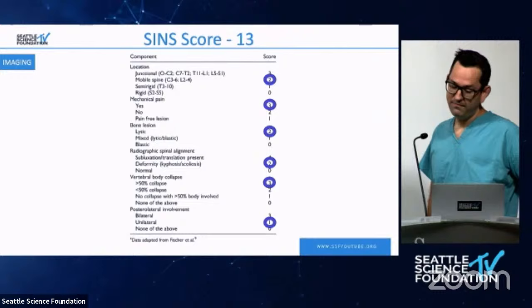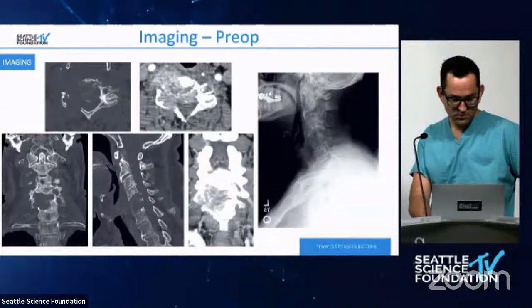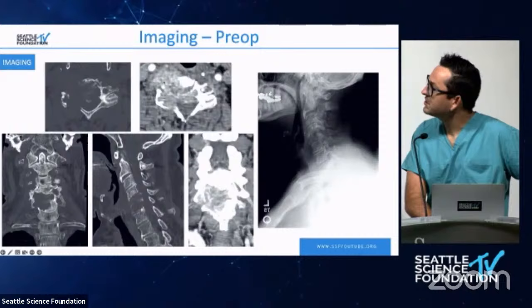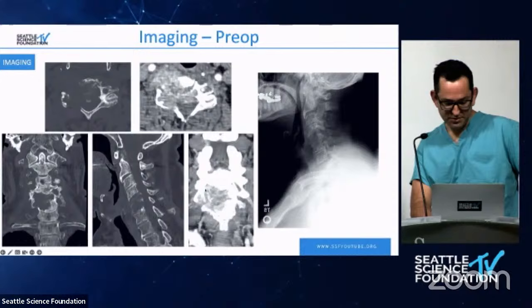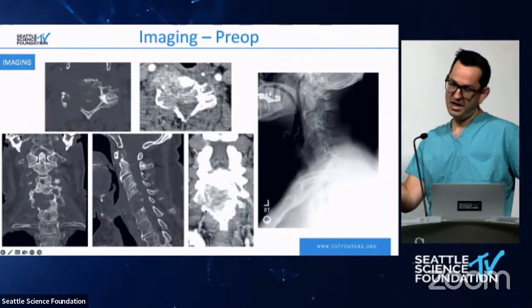And again, the vertebral artery condition, how was that identified? Did you do a CTA or? We have a CTA, you can see, I don't know if you can see that. Up, you can see the vertebral artery. It's definitely open. We follow all the way up. And on the coronal, I try to get a good slice of the coronal. You can see it there, eccentric off to the right side, but widely patent. There is some tumor that wraps around the side of it. That's ventral and a little bit lateral.